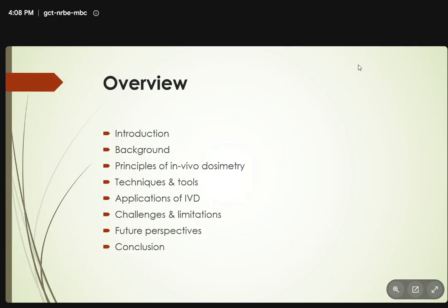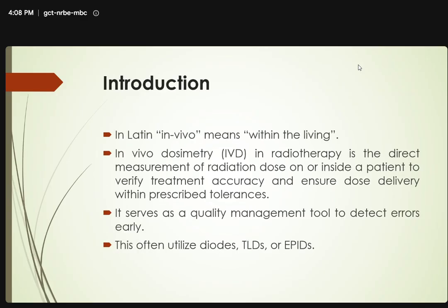Okay. So with this presentation, I will try to cover a little bit of introduction about in vivo dosimetry, some background and principle of in vivo dosimetry, techniques and tools, application of in vivo dosimetry, challenges and limitations of this, and some future perspectives, and we'll conclude after that.